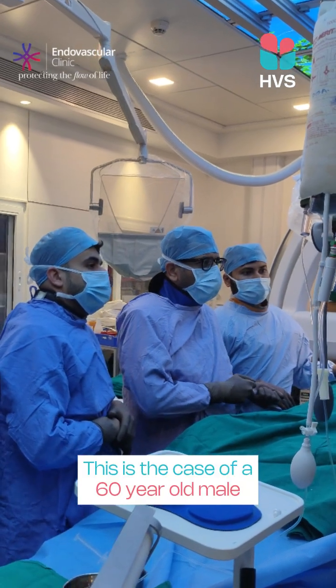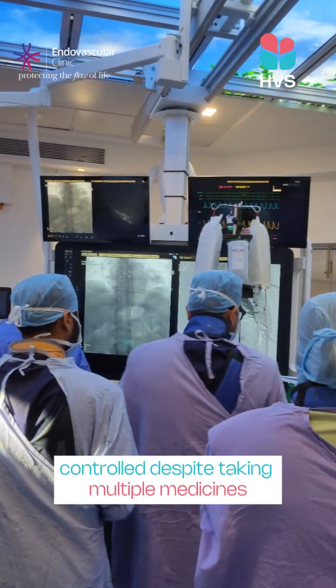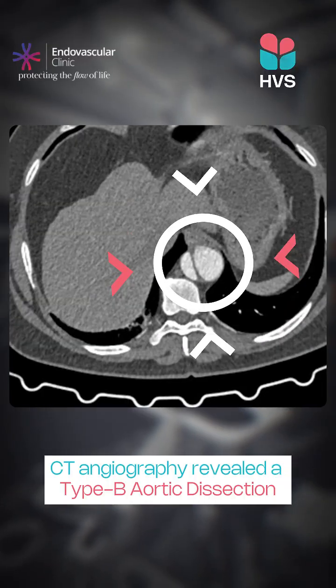This is the case of a 60-year-old male who presented with persistently high blood pressure that could not be controlled despite taking multiple medicines. CT angiography revealed a type B aortic dissection.